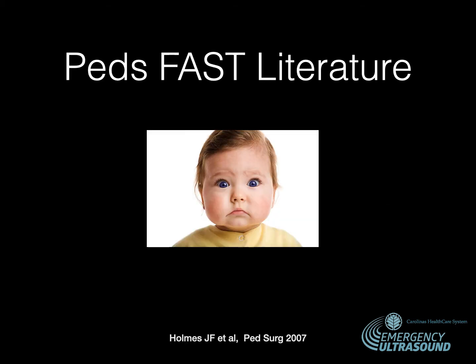What about in pediatrics? It's tough to study the FAST exam in kids. Usually they do pretty well and have no injury, so all of the studies are pretty low powered. The sensitivity and specificity is tough to evaluate as each study defines a true positive and a true negative differently. Some compare the FAST to any amount of free fluid on CT, even if it's not due to injury and only physiologic fluid. Some compare FAST results to whether the patient needed admission or operative intervention, and others do it somewhere in between the two.